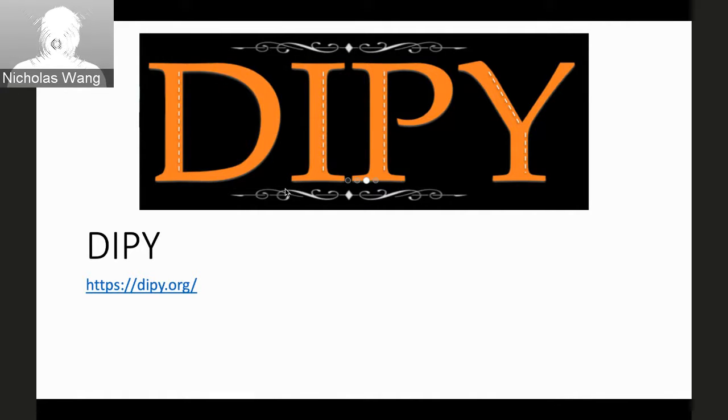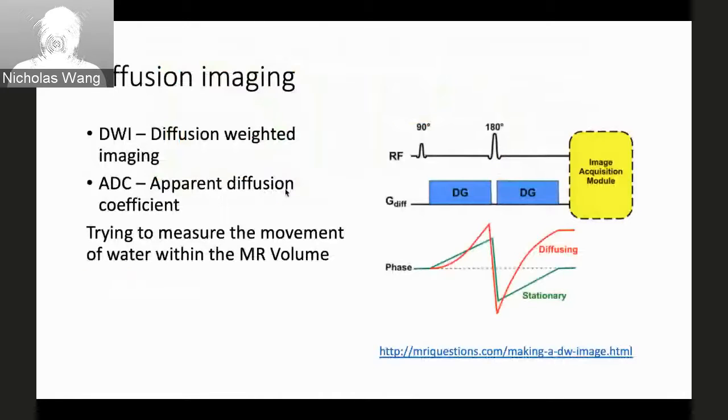But DIPy. Diffusion imaging is a different kind of imaging on top of MRI, where a normal MRI you're trying to see where the water, or the fluid, is moving within a brain, or a subject in general, a person in general, by doing this kind of diffusion gradient as well.